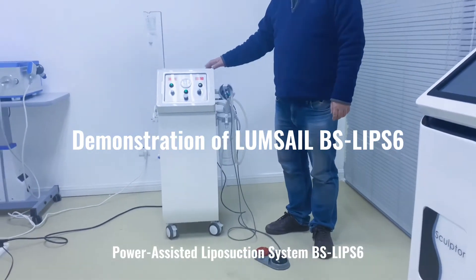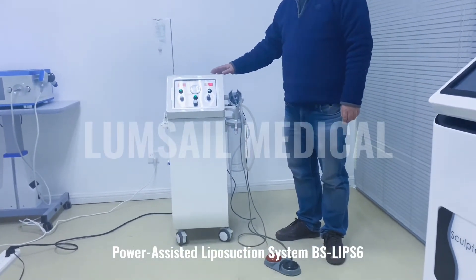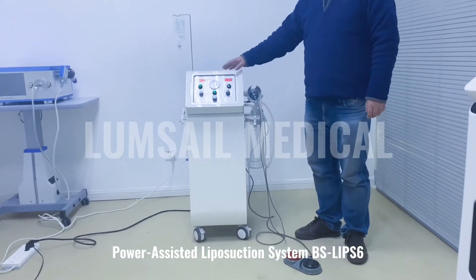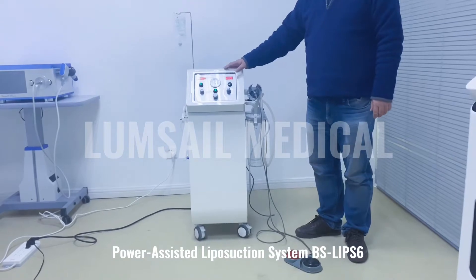Thanks for choosing the BS-LIPS6 model liposuction system. This is a high-energy unit with two pumps inside, which can improve the vacuum function.